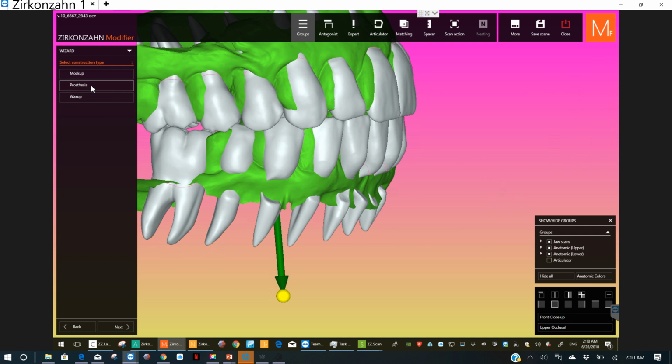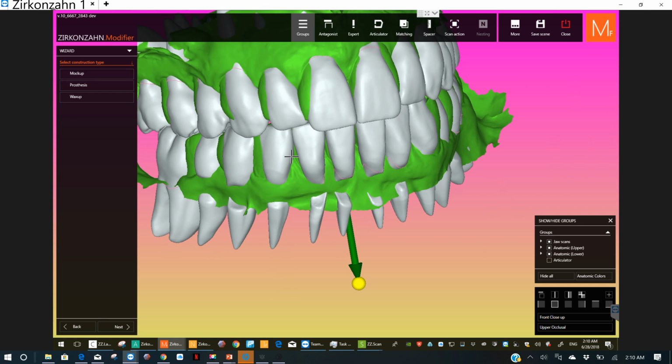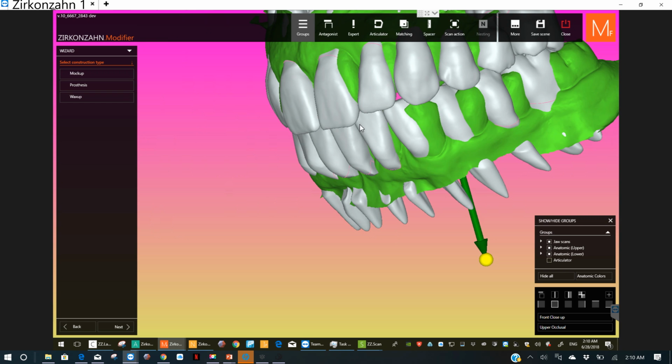This would make a denture or a bridge, but there's already teeth under it, so I don't want to make it over that. But if you had a gum model, a couple gum models there, and you hit prosthesis, you could just make a denture. But we want to do a mock-up. And a mock-up is kind of like that snap-in thing. So you can mill or print it and put it on. So I'm going to hit mock-up.